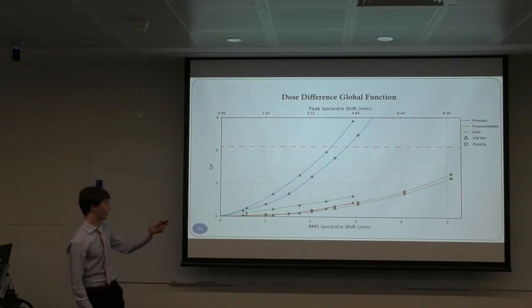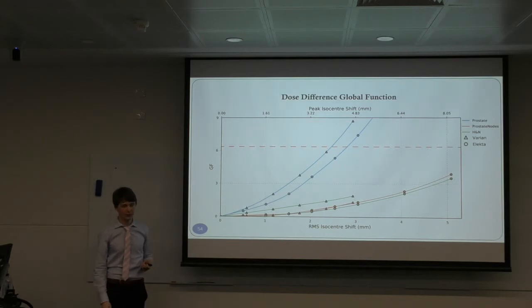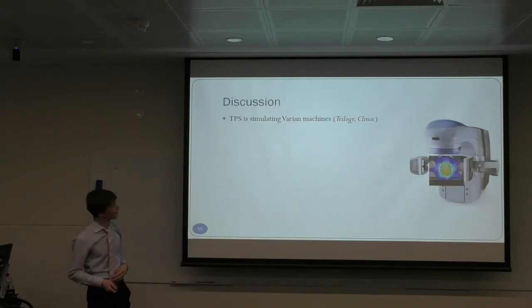So this was another sort of interesting result. The prostate didn't react so well to this, unlike the other two. So with this in mind, I'd still say 1 to, even like the 1.6 is fine as an acceptance criteria.